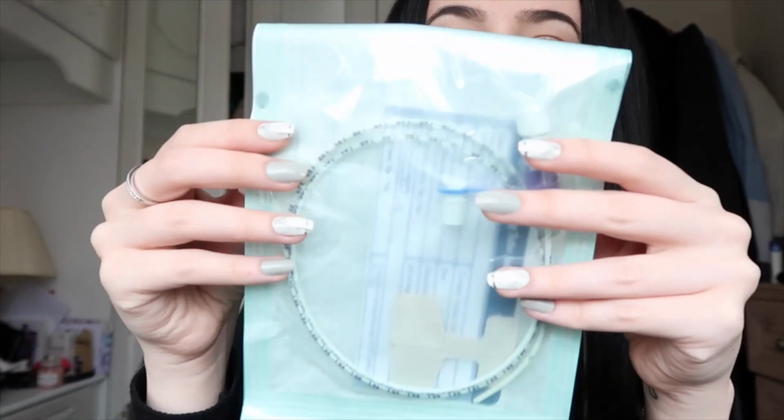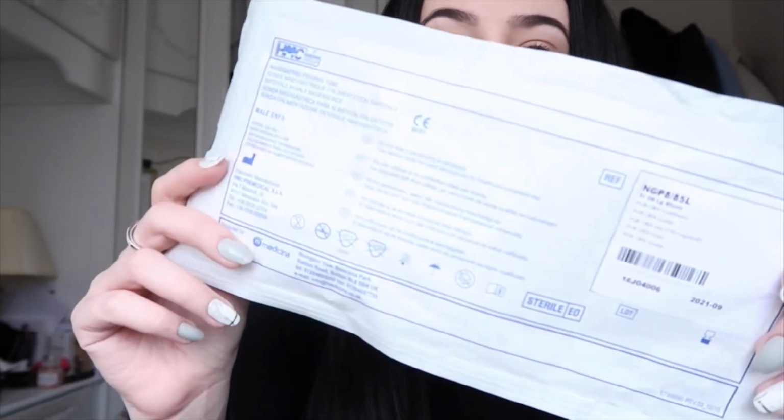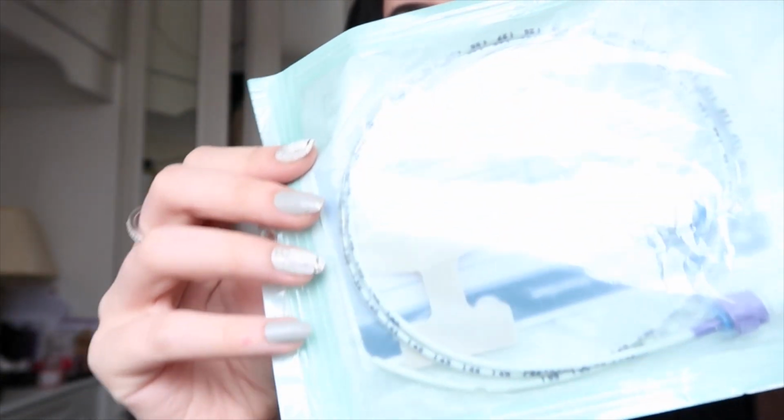And then of course you are going to need a tube. So this is the one we're using today. It is an 8 French long. It has a guide wire. I think these are just the nutrition ones. I don't know, it doesn't really say, to be honest. I don't know, it just looks like this basically. And then you've got the tube inside like that, all ready to go.